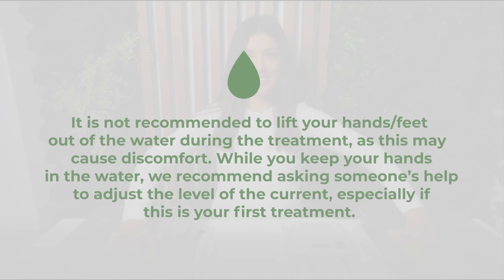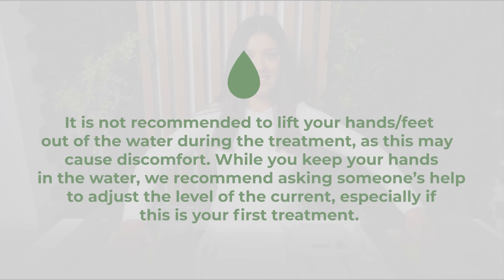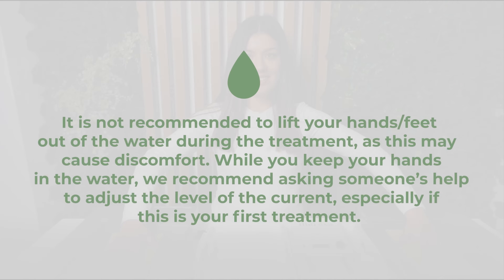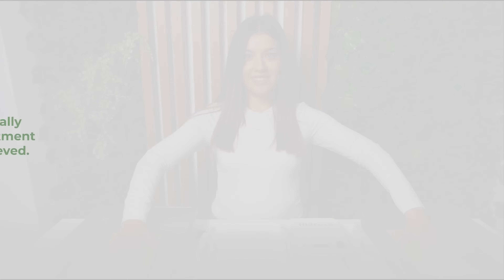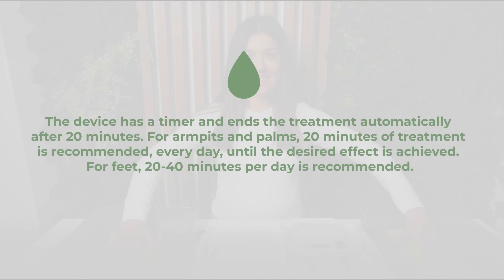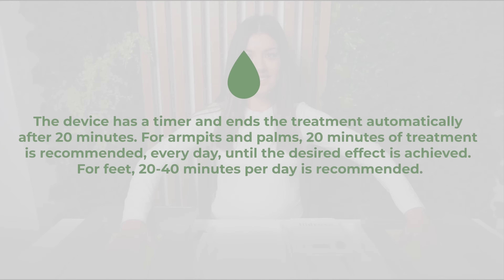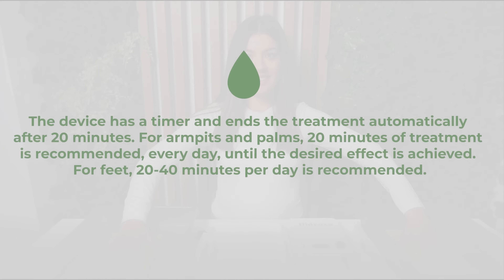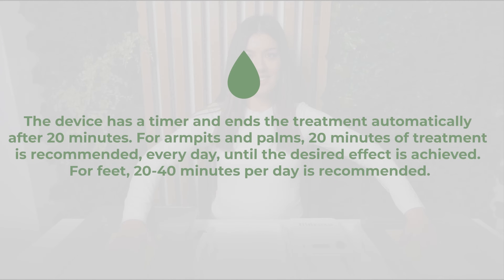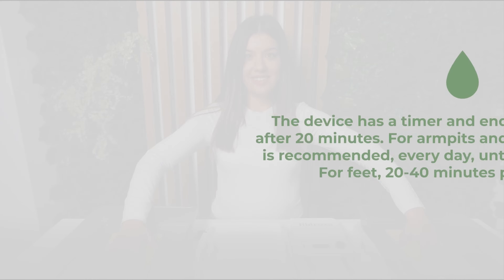While you keep your hands in the water, we recommend asking someone's help to adjust the level of the current, especially if this is your first treatment. The device has a timer and ends the treatment automatically after 20 minutes. For armpits and palms, 20 minutes of treatment is recommended every day until the desired effect is achieved. For feet, 20 to 40 minutes per day is recommended.